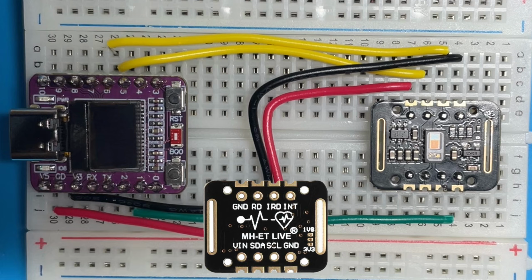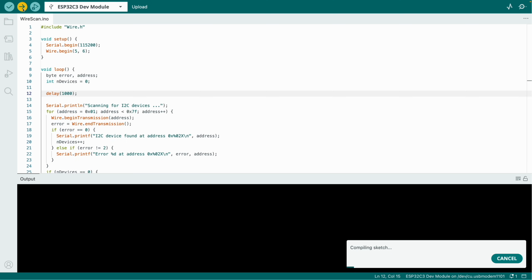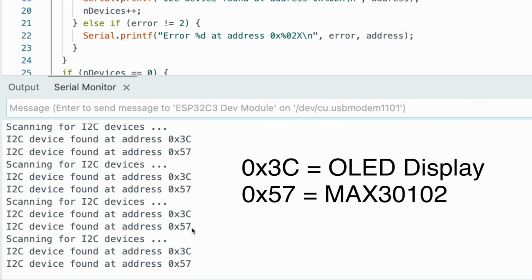Let's run the old wire scan, see if it actually detects it. Okay, so I've got the old wire scan sketch here. Let's upload this and see if it actually detects our heart rate monitor, and it should show up. Let's see what happens. So assuming I've got my wiring correct, of course, something should show up. So let's have a look. Do we have anything? Oh, there we go. Oh, perfect. So that's working. So 2 devices showing up. The reason we've got 2 devices is obviously we have an I2C display and we have our heart rate oxygen monitor. So that's working nicely.